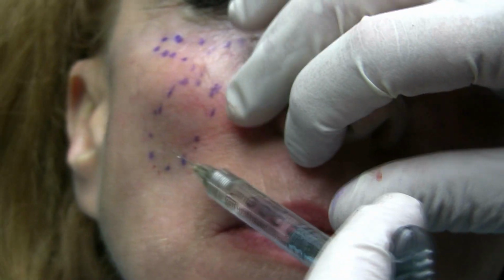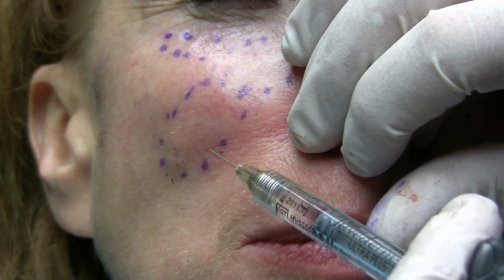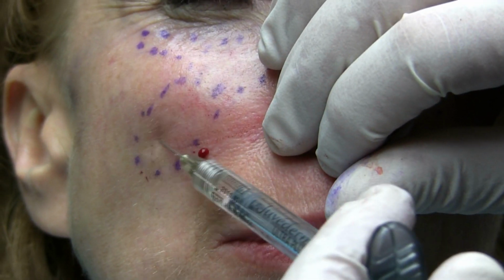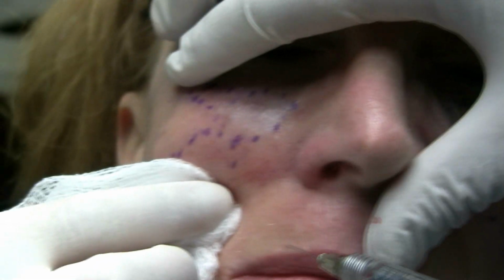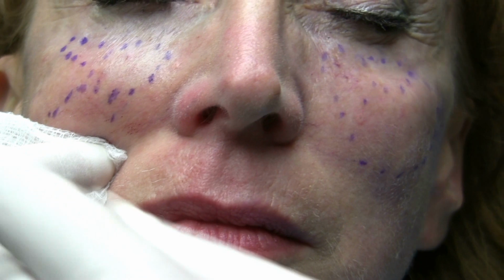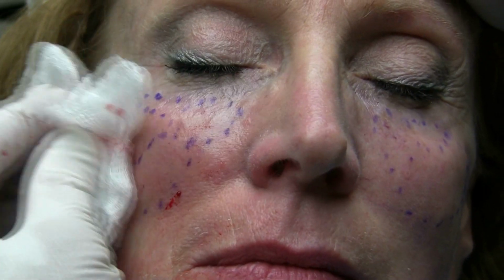And it's important to have good overhead lighting because the shadows are really important as well. And I've said it many times, and probably many times on this DVD, but if filler came in a caulking gun, we could treat everybody to fruition. So we'll go back and we'll massage all these areas, and I think it's very apparent the positive changes that we've made.